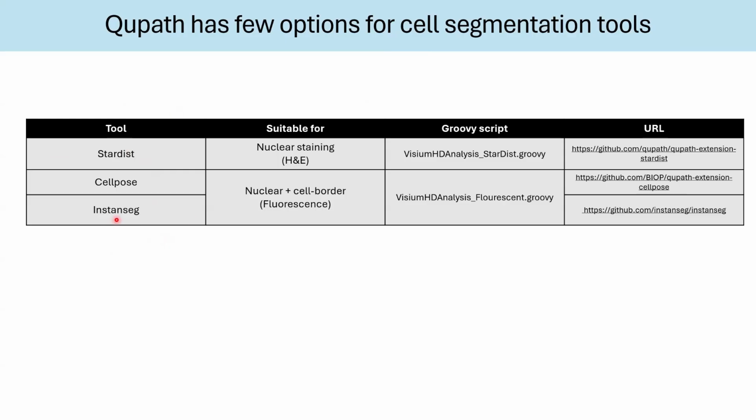Overall, those tools are great, easy to install, and very powerful. They also allow you to train a custom model, which is especially good if you have a tissue that isn't looking like the ones that were used to train the default models.